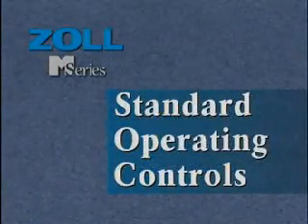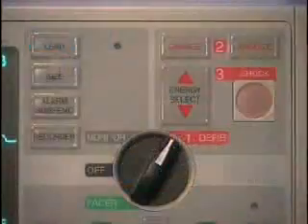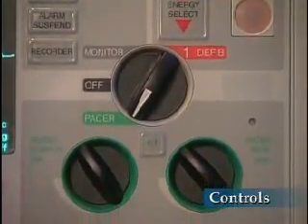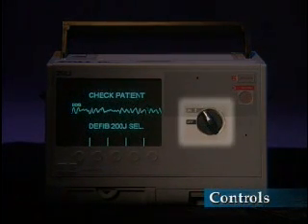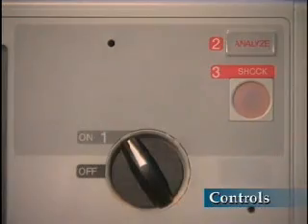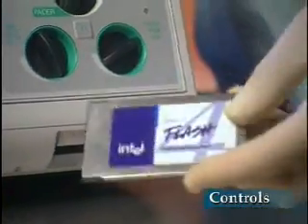Let's begin by looking at the standard operating controls. The selector switch enables defib, monitor, off, and the optional pacer modes. Semi-automated versions of the device have a single on position which activates the monitor and defibrillator. All units will beep four times, indicating they have passed the power on self-test. If PC-MCIA cards are inserted, ECG data and patient event information will be recorded.